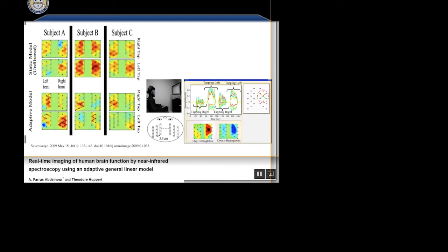the major problem with all of these methods is that they assume, call it, independence between your task and your physiology. I said yesterday that if I even do a finger tapping task, or certainly running on a treadmill, my heart rate went up correlated with the task. And so separating out, based solely on the time course, what is cardiac, what is systemic versus the brain signal is going to be very difficult. Ask the question again after we go through the spatial methods, because in that case, the spatial methods are going to be what helps you, okay?